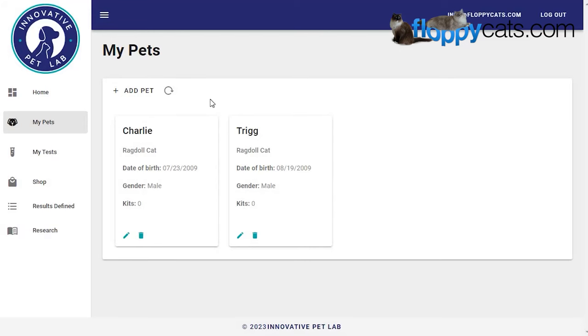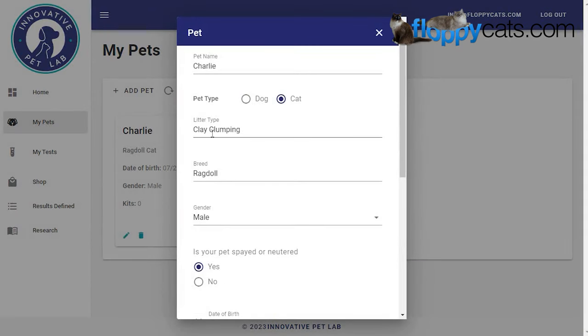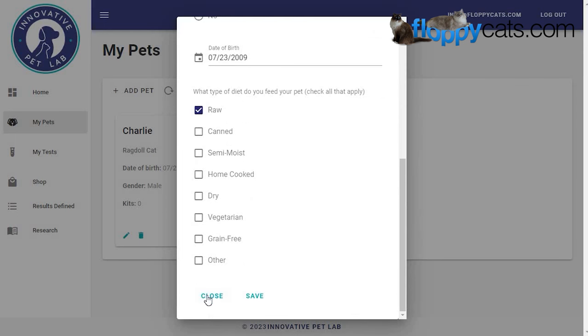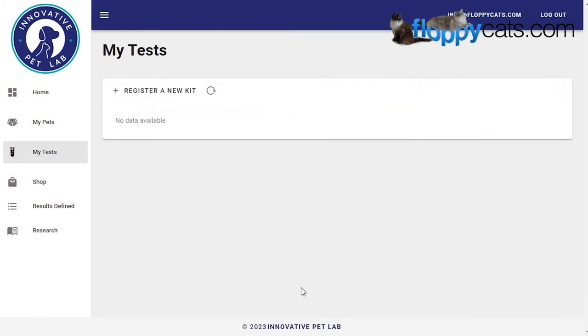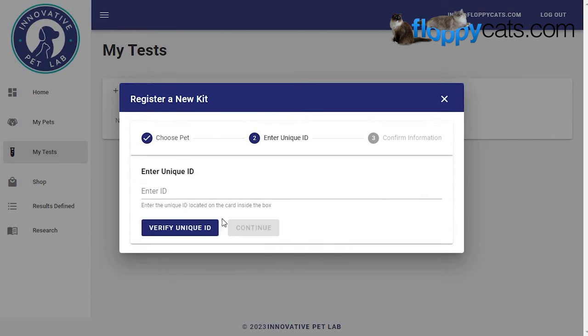Here's the back end of the Innovative Pet Lab website. First, you register your cats — their date of birth, litter type (which is different from what I've experienced with Animal Biome), whether they're neutered, and their diet. I'm proud to click 'raw.' Then you register a kit: first you select your pet. I just picked up Charlie's poop, and then I enter the unique ID that was inside the kit.